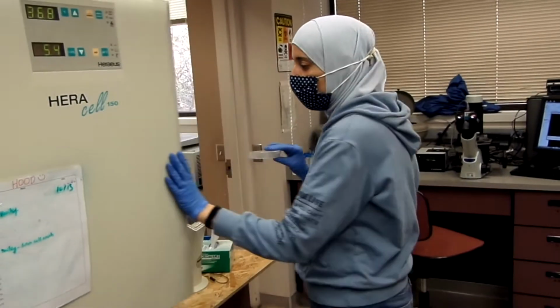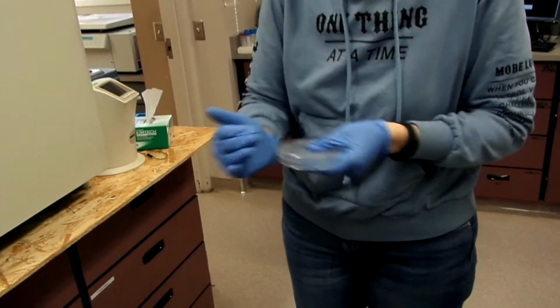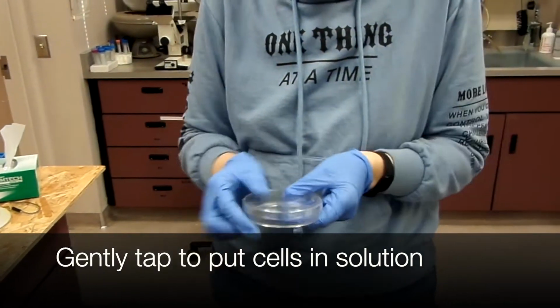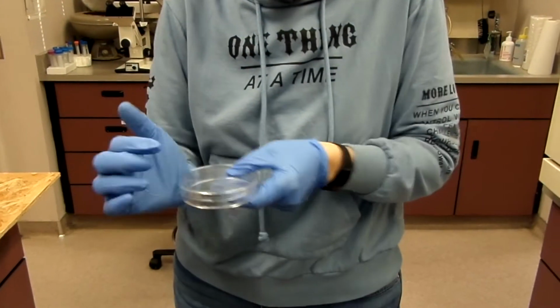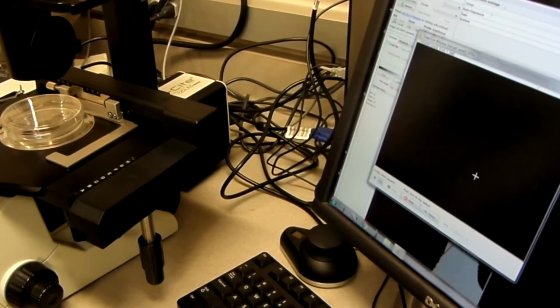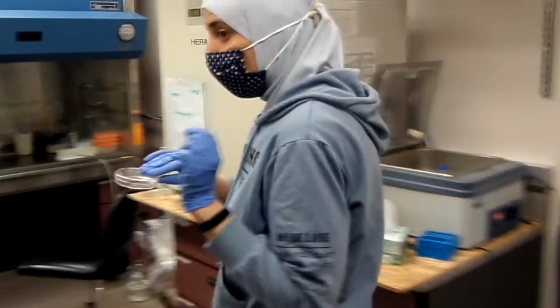One thing I like to do is just to try to dislodge the cells and not be too aggressive. I just knock the plate a little bit. Let's take a look. Okay. Can you see that the cells are floating? Which means they have dislodged. You see? Which is good.